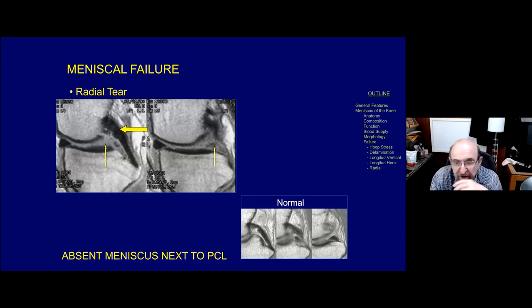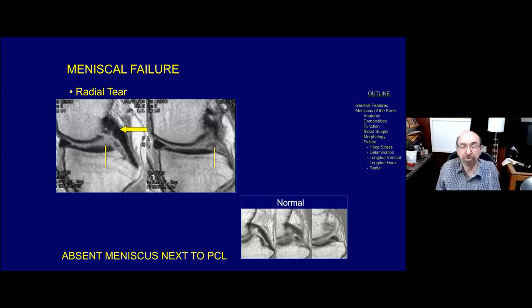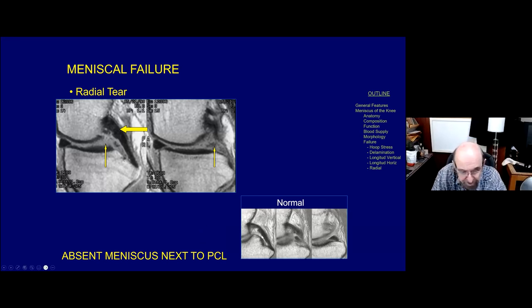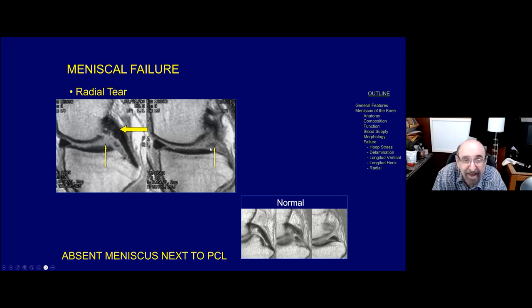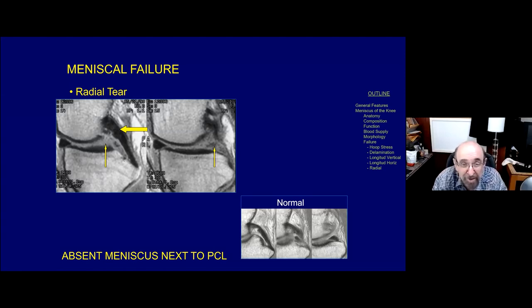Here's a case showing three sagittal sections A, B, and C - you can see a marching cleft going all the way out to the periphery. This is not a longitudinal vertical tear - this is a parrot beak radial tear. This is another critical area: the normal sagittal appearance of the posterior horn of the medial meniscus shows a significant amount of meniscus on the image next to the posterior cruciate ligament, and the next medial image should show the entire meniscus. If that next image shows virtually nothing, that's abnormal - that's an abnormality of the posterior horn of the medial meniscus, or potentially the posterior root ligament.